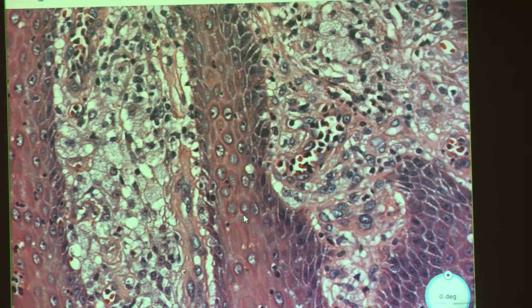That's kind of it, because there is some scattered inflammation, which you can see with these. We did talk about the thickening of the epidermis. So what do you think this is? Since clearly I'm telling you this is not a verruca.